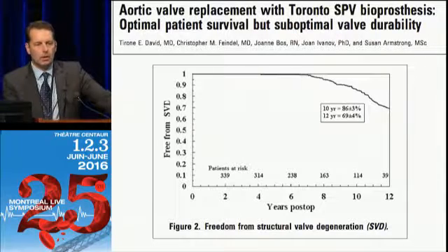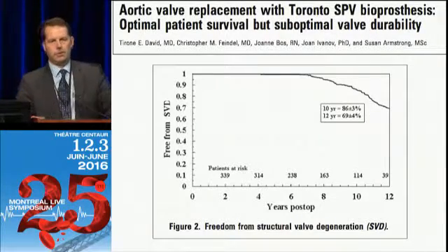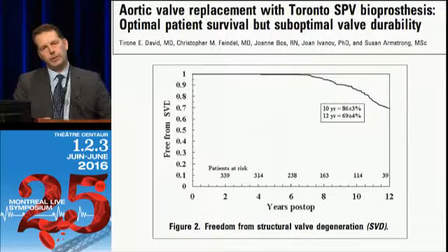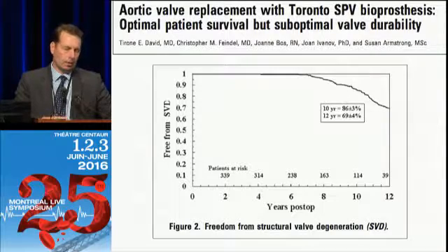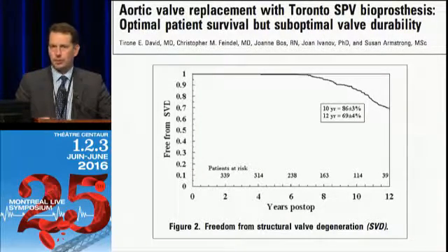You know, it was interesting to hear Danny DeVere's talk a couple weeks ago, because the issue of durability is one that in our own surgical valves we have faced as time has gone on. And we'll talk a little bit about some of the sutureless valves. And the question this morning is, why don't they just replace our standard valves? And the issue is durability. This is the Toronto SPV valve, which looked great for the first 6 or 8 years. And what you see is that starting at about 8 to 10 years, we saw structural valve deterioration that was quite significant, and this valve is no longer on the market.